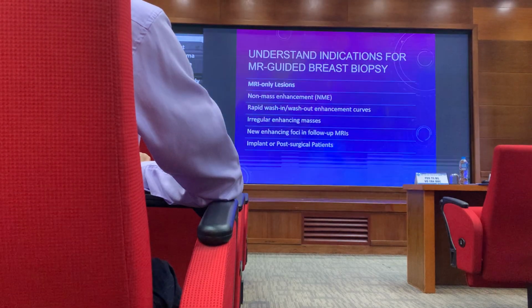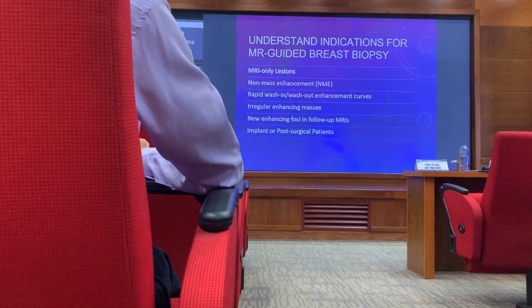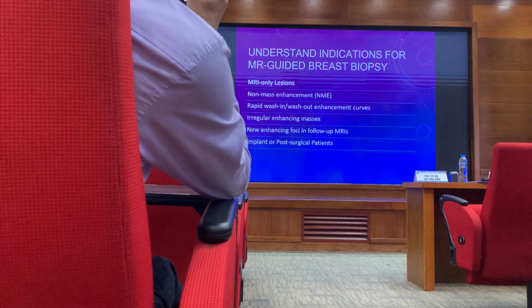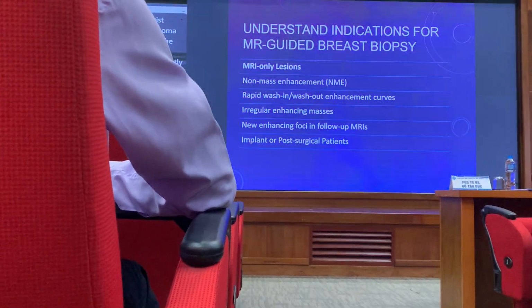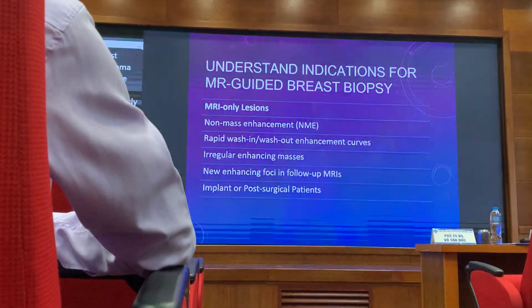Okay, we need to understand the indication for the MR guided breast biopsy. We can already do it under ultrasound biopsy or mammogram biopsy. Why do we need to do it under MRI breast biopsy? It's higher cost, right? It's more expensive, and we need to make sure all the gadgets are not metal, isn't it?